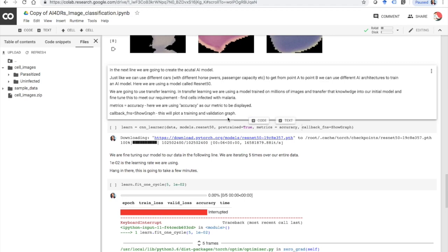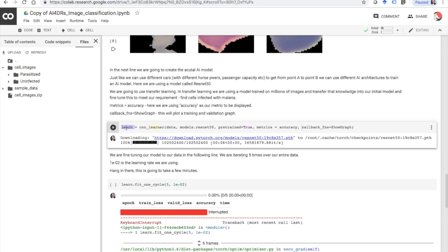Now in the next line we are going to create the actual AI model. We're going to call it 'learn' and create it using the CNN learner command, passing the data we collected from the folder. Just like we can use different cars with different horsepower, passenger capacity, and so on to get from point A to B, we can use different AI architectures to train our model. Here we are using a model called ResNet 50.